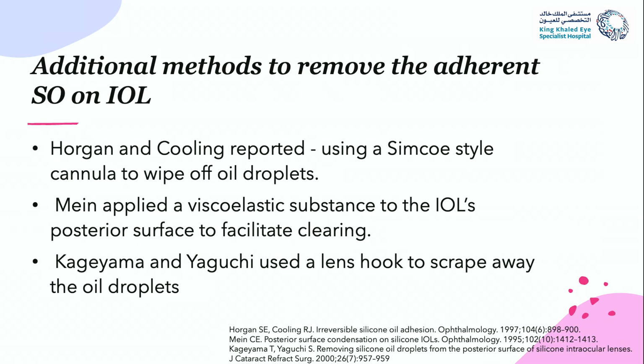And other people have suggested using a different technique. I found that the technique using the perfluorocarbon fluid is probably the most efficient way. And the other one that people use is a Sinskey hook, using a lens hook to get rid of it, which sometimes works, but doesn't always work well.